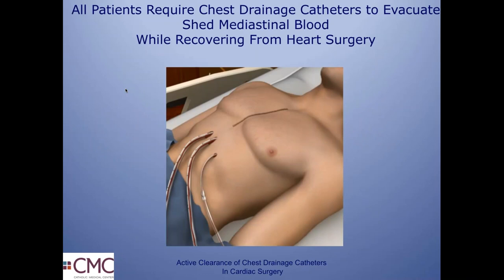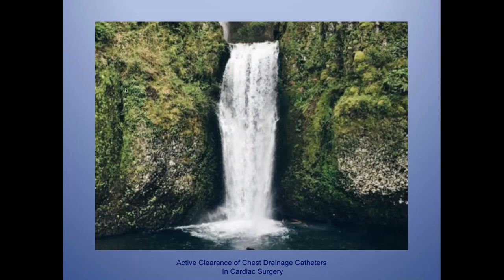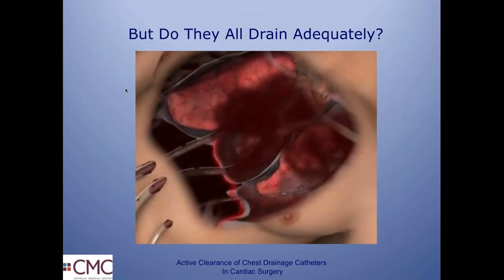Well, we all know as surgeons that when we operate in the chest, particularly on the cardiac side of things, you better get the blood out very quickly and efficiently. Otherwise, you have problems of compression or ongoing bleeding. The standard way of doing this, as we all know, and I'm sorry if I repeat myself a bit, is with chest tubes. Sometimes you have good days, the drainage is slow, and we can manage things very easily, or sometimes we're called back at night because it's continuously bleeding.